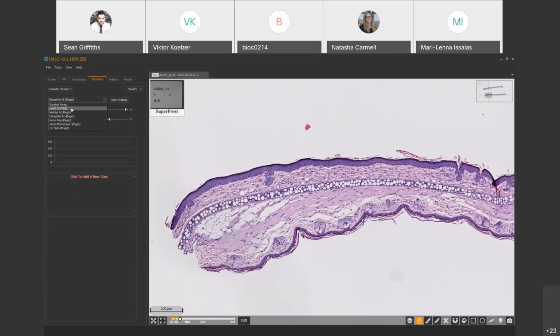So we decided to configure the software with a Python plugin, so you can actually configure networks and add your own networks to Halo, and you can make the training marks through the Halo GUI, but it's essentially your network. So if you have anyone amongst you who's competent in Python, and you can use this fairly, as I understand it, basic programming language to configure networks for your use. We also have some documentation on examples of how users have been able to do this, and it'll give you almost a walkthrough guide of how to do it if you did want to add your own plugins.